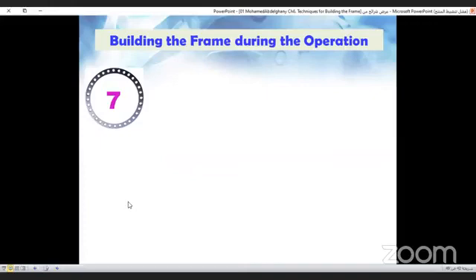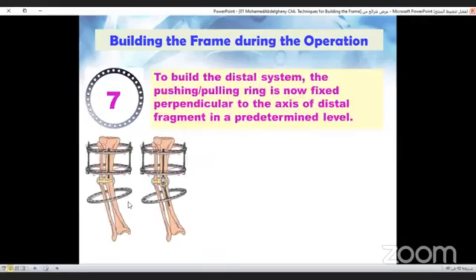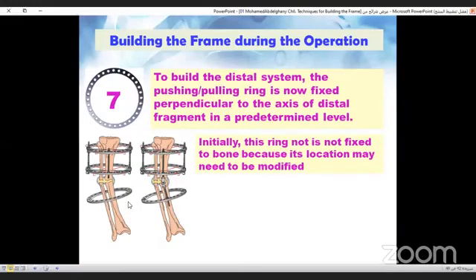In step seven, the distal system is now started. To build it, fix the pushing pulling ring perpendicular to the axis of distal fragment. This ring is initially left unfixed because its location may need to be modified later.